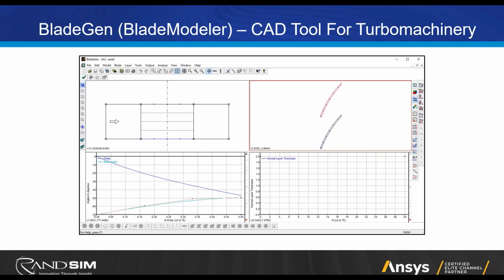This blade-to-blade view, that's another nice view that designers use because it allows you to see the blade in 2 dimensions and completely. But again, that uses these developed views, the meridional distance, which is through here, the flow path, versus theta, the amount of wrap that you have in the blade. And down here are the blade angles where you can control those. Beta is the blade angle itself, the lean of the blade, if you will, and theta is the amount of wrap that you have around the hub, if you know how many degrees of wrap there is in the blade.